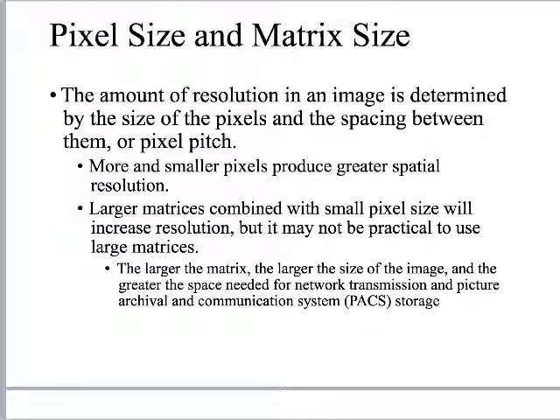That, at the end of the day, though, does have some impacts on PACS, right? So as we improve spatial resolution, we might also have to upgrade our PACS storage space, right? Because if we're getting more and more information, if we're capturing more and more spatial resolution, we just increased our file size significantly. So it does affect storage.